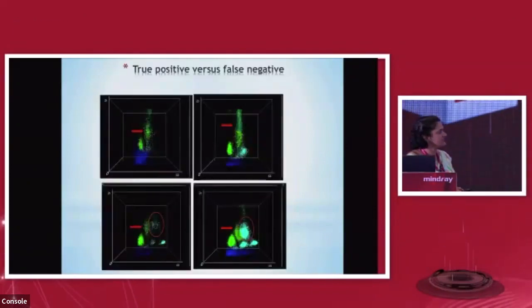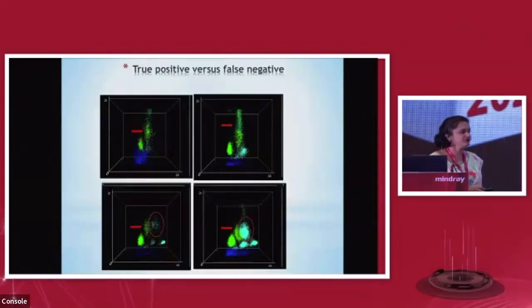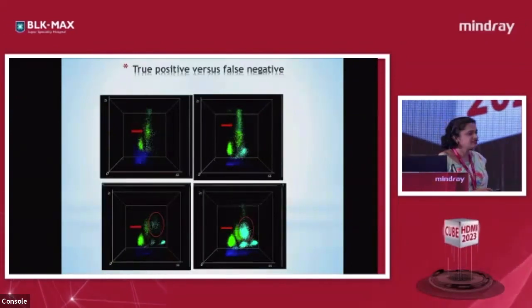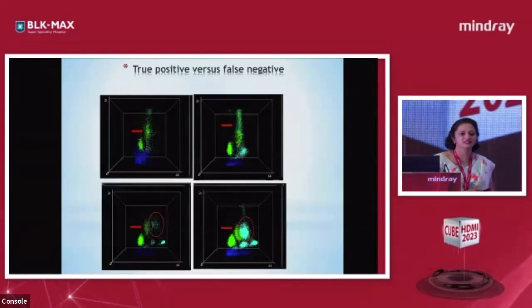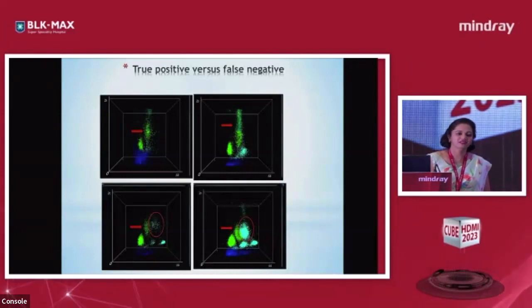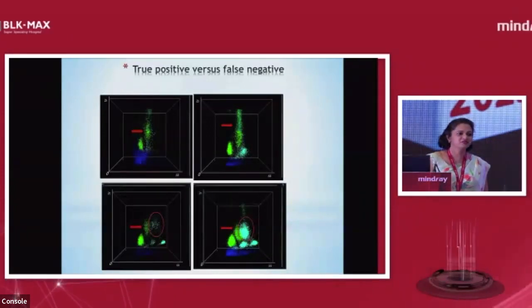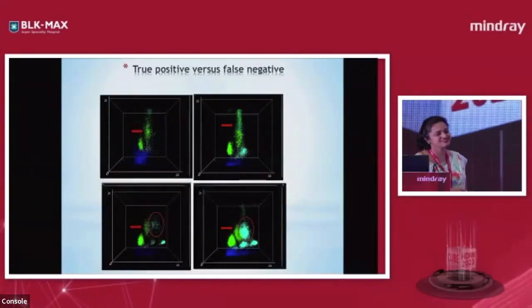So those are the first two cases which are true positive, and then below, the red circle is pointing towards the HFBF area in the false negative cases. So I actually want input from the people who are present here to solve this particular issue, and especially Dr. Ramon Simmons, sir.